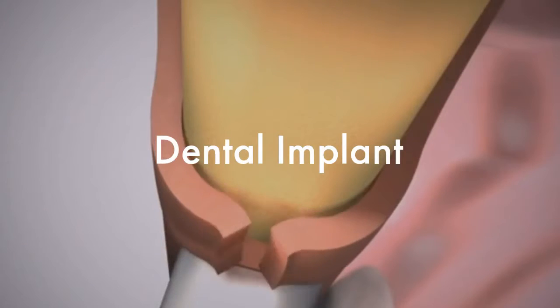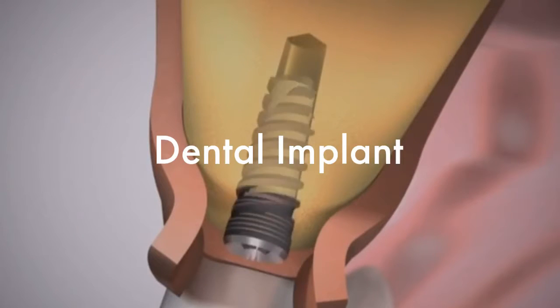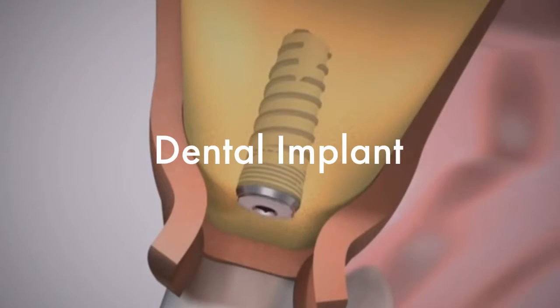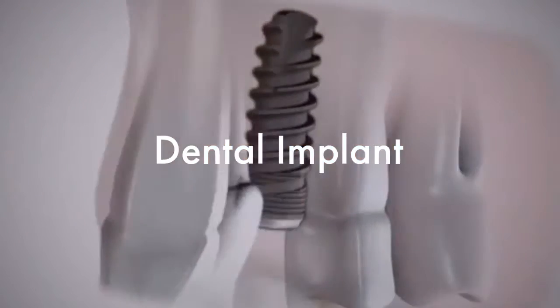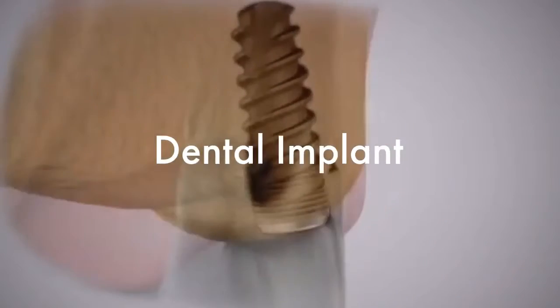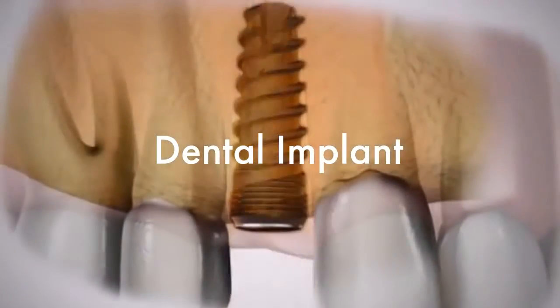The implant is placed into the bone under local anesthesia. Within a few months, this initial implant will become a firm foundation set naturally in position, replacing the natural root. The space of the missing tooth is filled by a temporary crown.